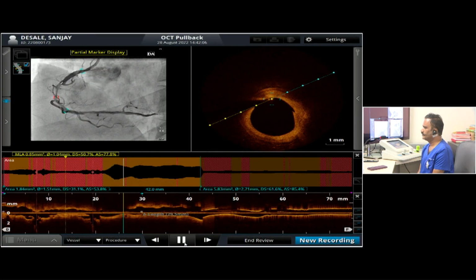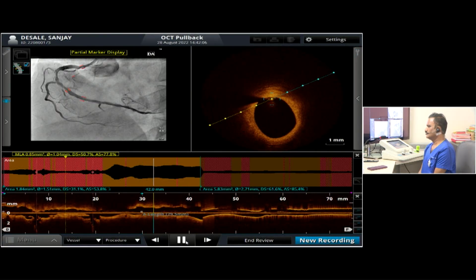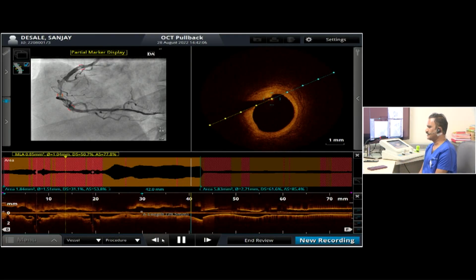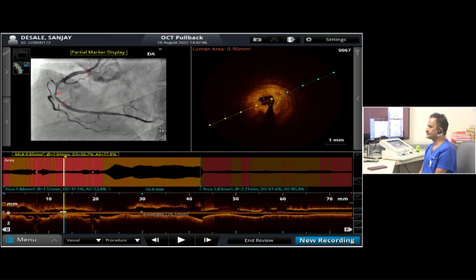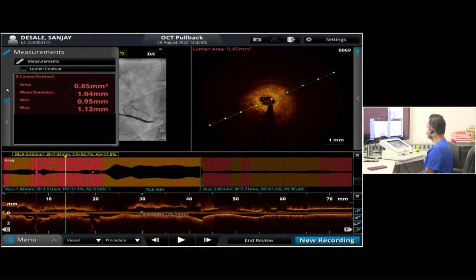Yeah, from here you can see the lesion is tight, but again this can be a point for proximal placement. The artery measurement there is around 3.6 and 3.7 in two different angles, and distally it's around 3 millimeter. So total length is around 30 millimeter on this, but distally also the plaque is there, so the landing zone I think will have to go down slightly. So it will be a 3.5 by 38 stent. We'll choose according to the OCT. We'll take a 3.5 by 38. Yeah, we are taking a 3.5 by 38 Onyx.